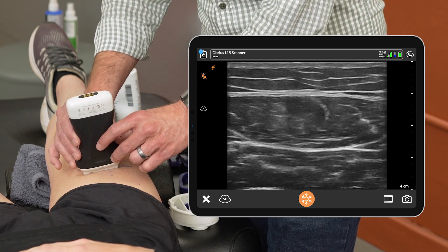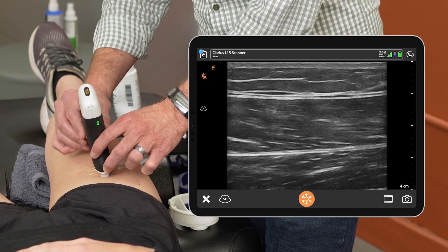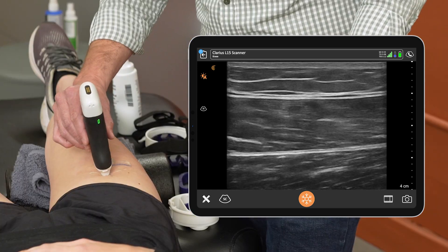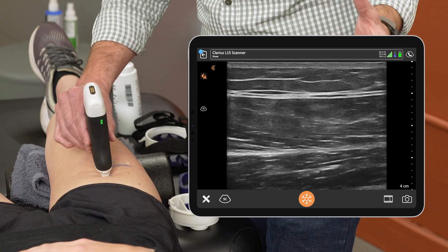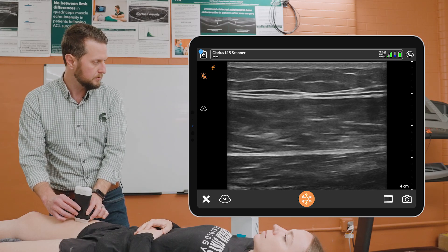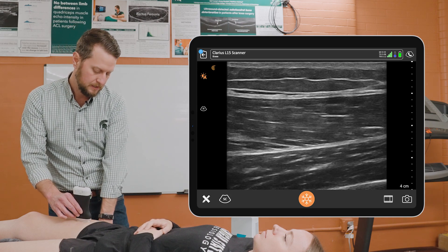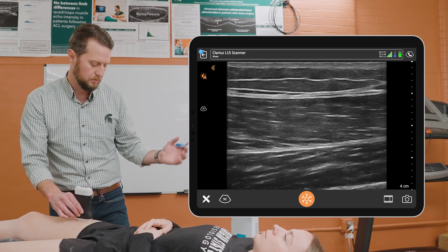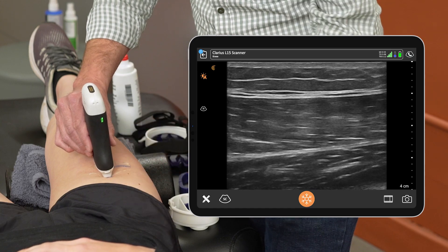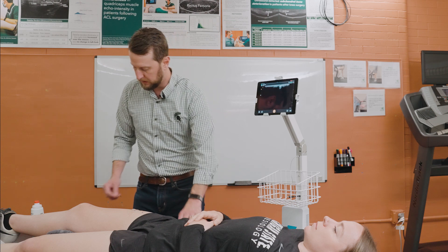Once we're able to identify this muscle, we'll actually turn the probe longitudinally so that we're able to gather this longitudinal assessment of the rectus femoris in line with that 50% mark, where we're able to see these individual muscle fascicles going through the muscle. Once we have the longitudinal positioning, we'll make a mark at the top of the leg above the probe so that we know where we're wanting to image that muscle.